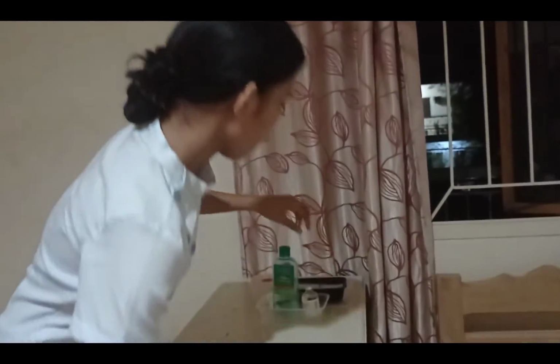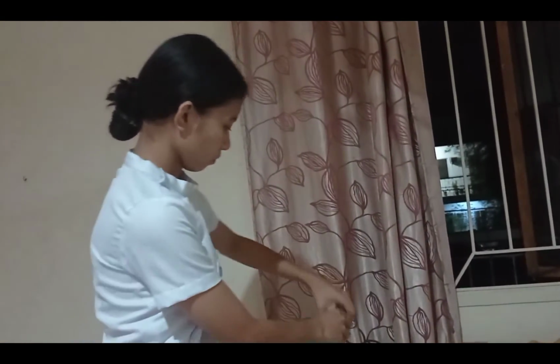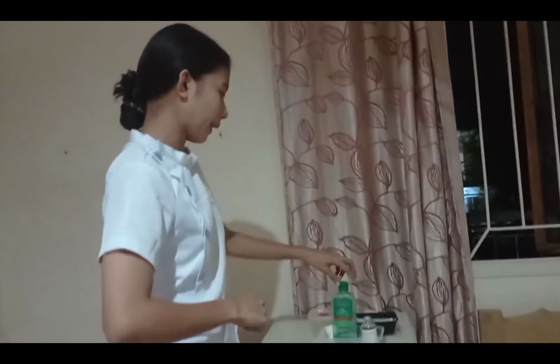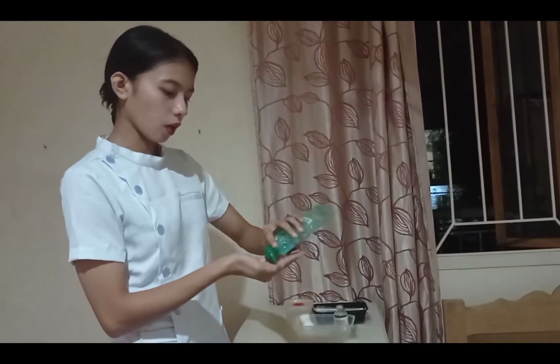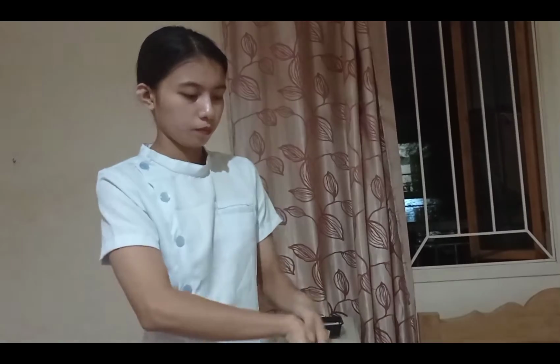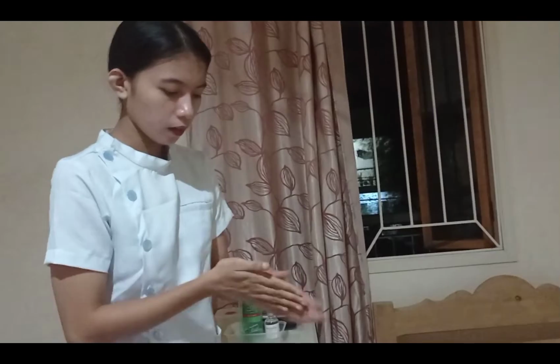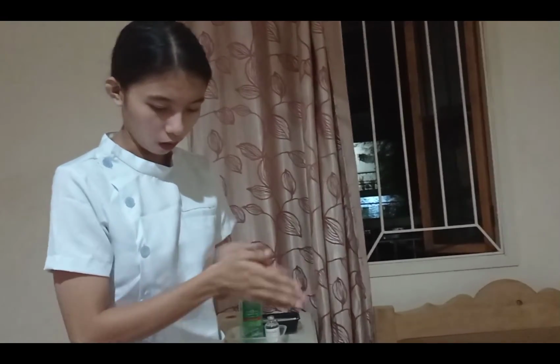The next is to prepare the vaccine as per agency policy. We first ensure that the vaccine is properly identified by its name, the manufacturer, and expiration date. Perform hand hygiene using the ABHR that contains 70% alcohol solution. Then let the hands dry for 30 seconds.